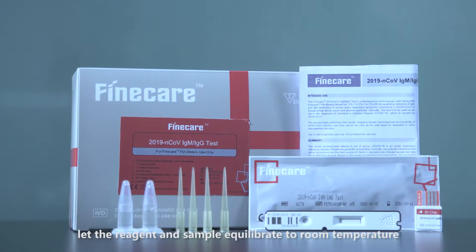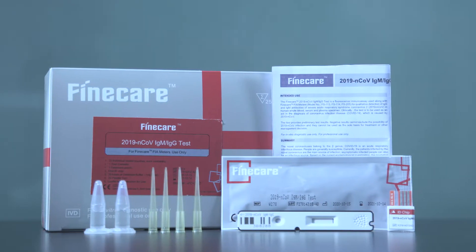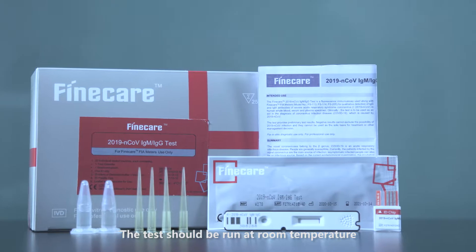Before testing, let the reagent and sample equilibrate to room temperature. The test should be run at room temperature.